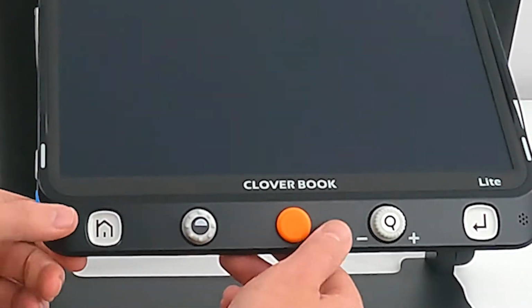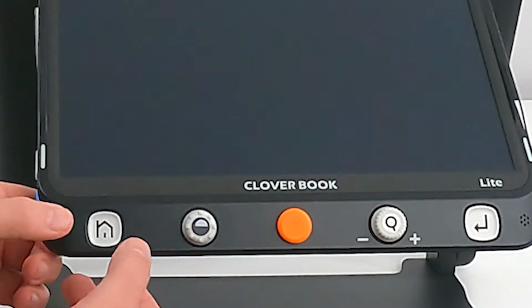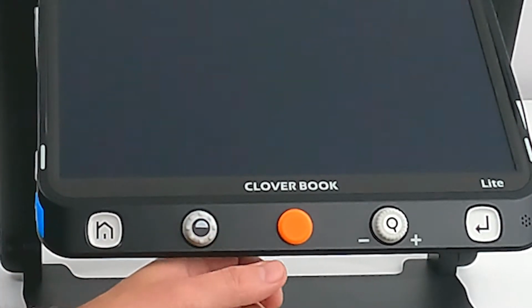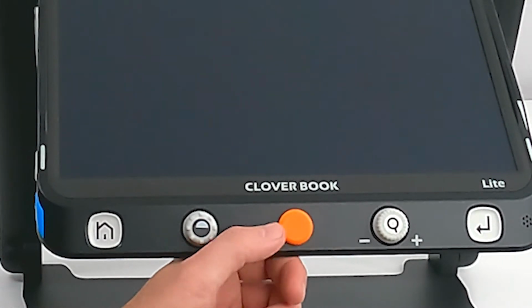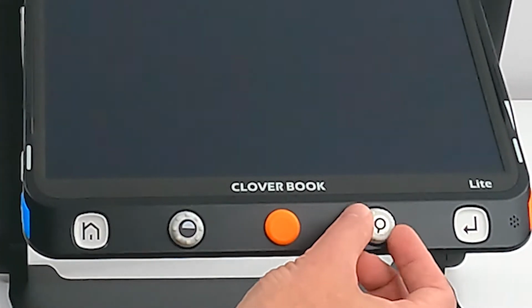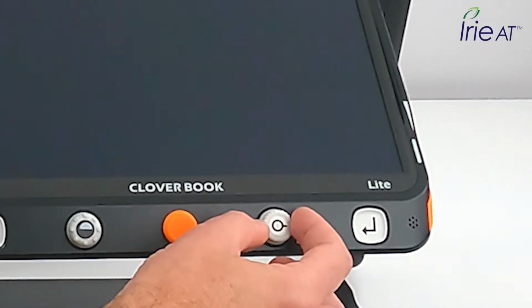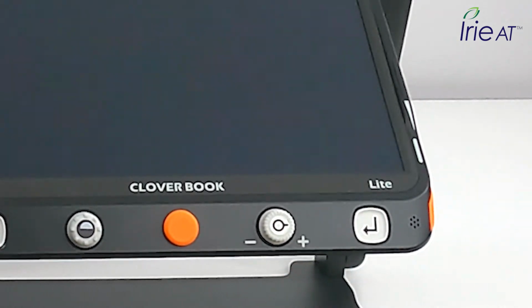I'm just going to run quickly through the front panel controls, tell you what those are, and then I'll show you what they actually do. On the left side, we've got the home button. We've got then the contrast color control knob. In the center, going across left to right, we have our joystick for live and still panning, and I'll show you how that works. We have an actual zoom wheel for changing magnification, also as a touchscreen, so you don't have to use that, but a lot of people like the traditional wheel. And then an enter button on the far right side of the front panel.